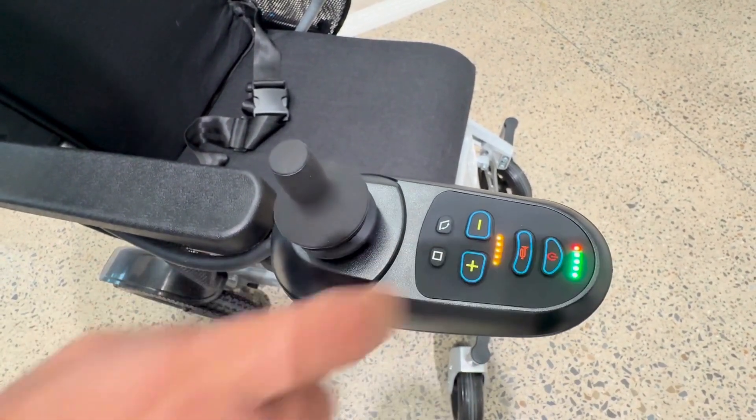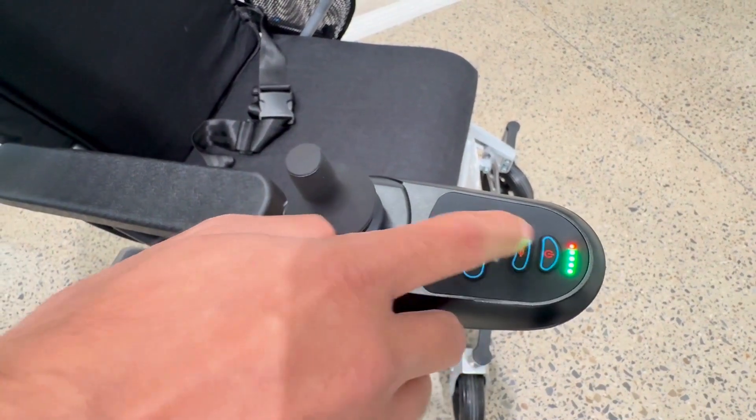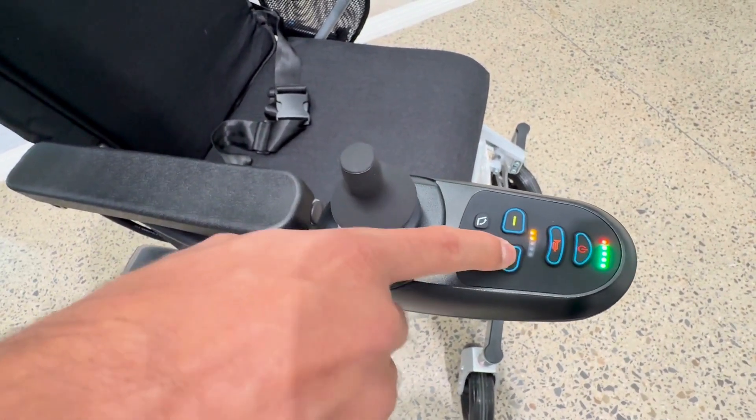Once you press this power button, the wheelchair will be on. These are the battery indicators and these are the speed bar indicators. Once you press this button, it will decrease the speed; once you press this button, it will increase the speed.